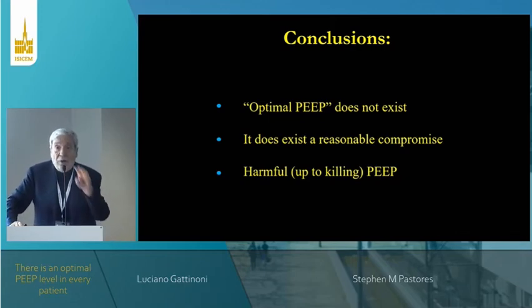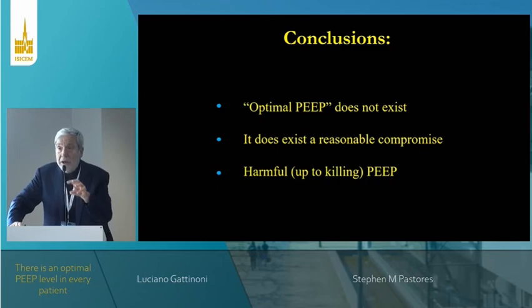And what we know now, what we must do, is to avoid the harmful PEEP. Because any time we play with mechanical ventilation, we just buy time. And we have to buy time at the lowest iatrogenic cost possible.